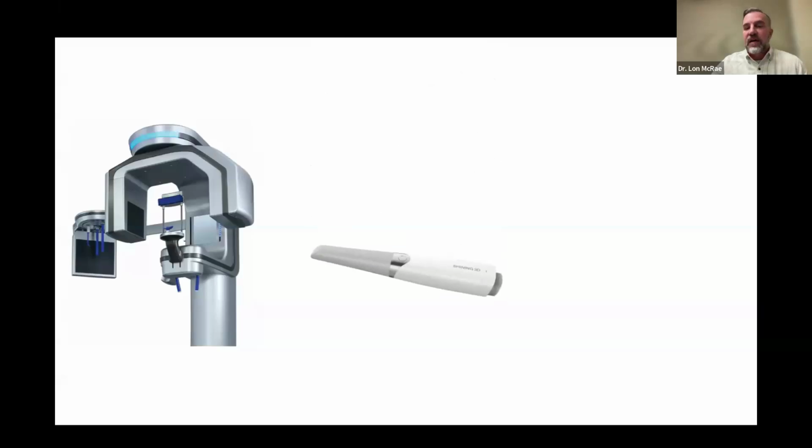Then we scan it. I've used a bunch of different scanners. What I'm finding out on scanners today, there is a plethora of different companies that have scanners. And from the research and from actually CRA, Gordon Christensen, they almost all are really good these days. Really good. The accuracy is absolutely fantastic. I just talked with my main lab guy, and I said, from traditional impressions to the 3D scanners, what do you think? Which is more accurate? And what we're finding is that we're pretty sure that the scanners are actually more accurate than traditional impressions.